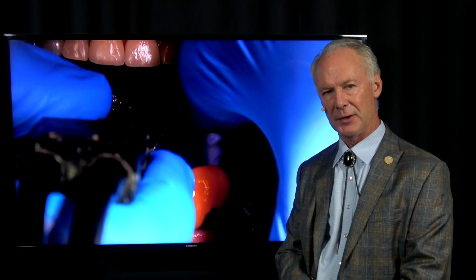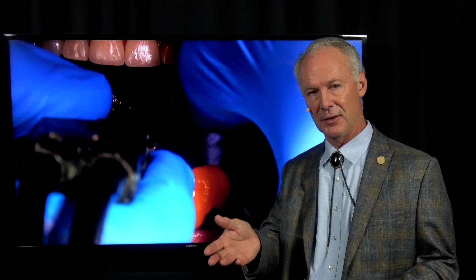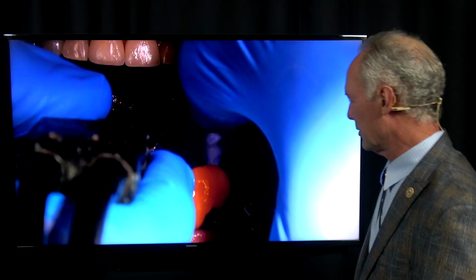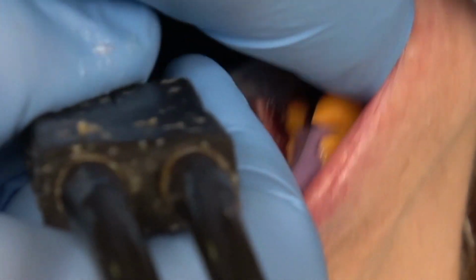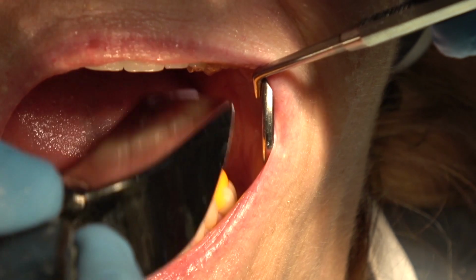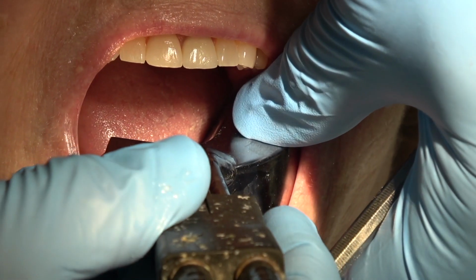And the second impression may just be used as a solid model to perfect the interproximal contacts. Watch the video in the library of dentistrymasterclasses.com on how to never have to adjust another interproximal contact using the solid model to perfect those interproximal contacts. Now this is just a quadrant impression. So the first one was a full arch, and this one's a quadrant.